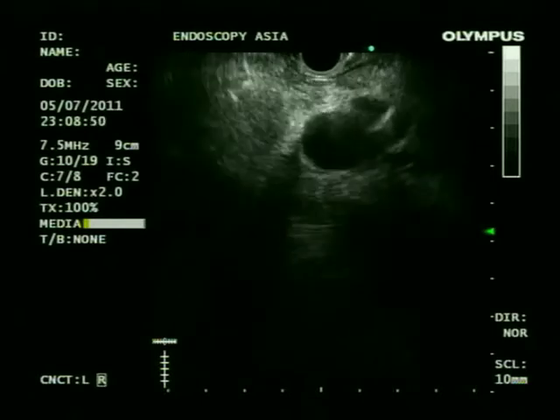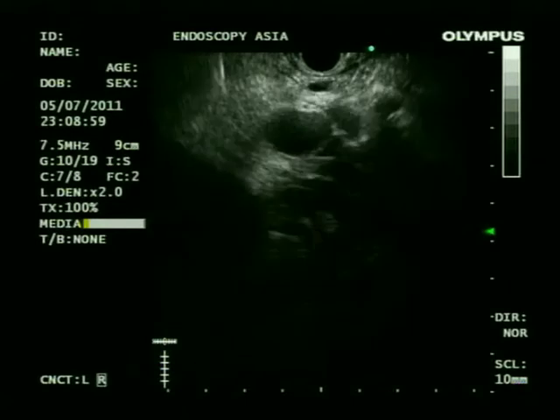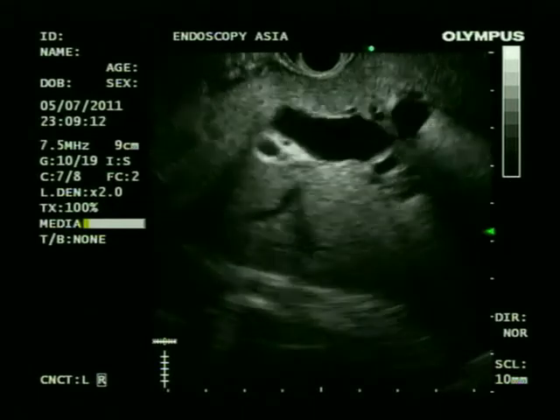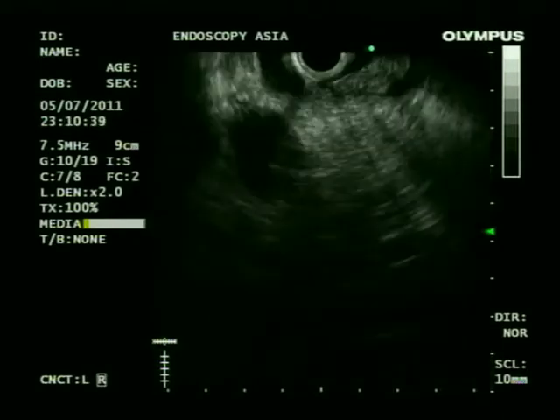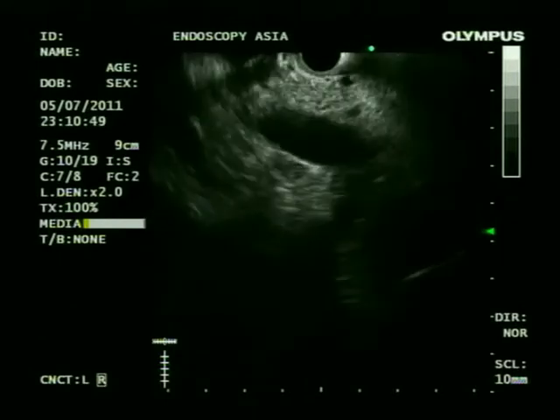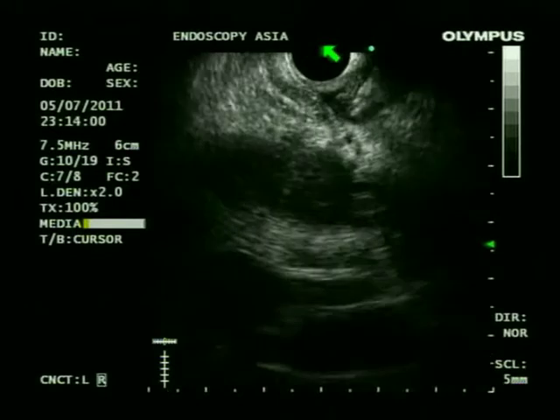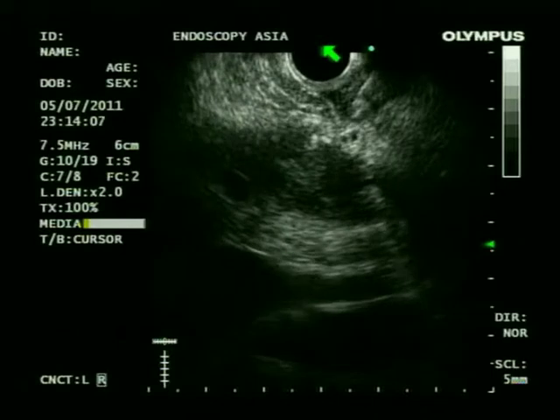So you can see here there is a lesion seen from the stomach, dilated system. We are chasing the left hepatic duct up to the common hepatic duct. That's a technique which we employ. Here you see dilated IHBR in the left ductal system, and I'm trying to rotate my scope clockwise and try and get into the position to see the hypoechoic lesion affecting the common hepatic duct region. Now you can see the common hepatic duct area where you can see the lesion, and transgastric route.